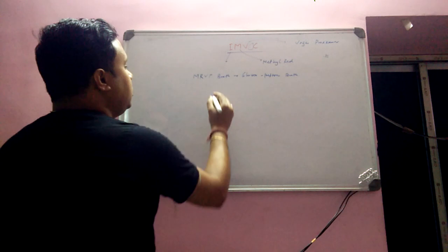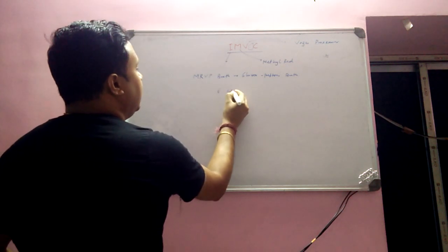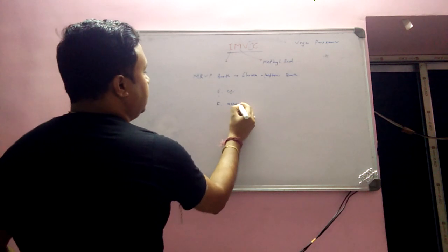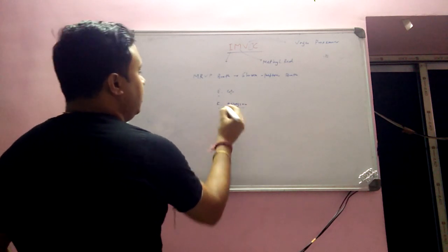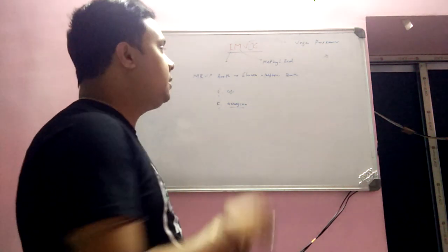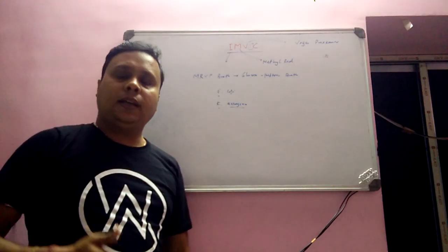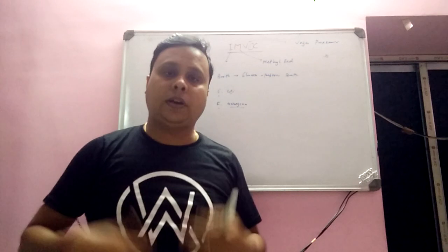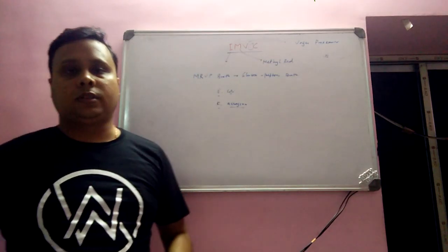Now, say we are choosing E. coli as fecal and Klebsiella aerogenes as non-fecal. Both of these organisms utilize the media differently. E. coli can ferment this glucose peptone more rapidly than Klebsiella aerogenes, and that is why E.